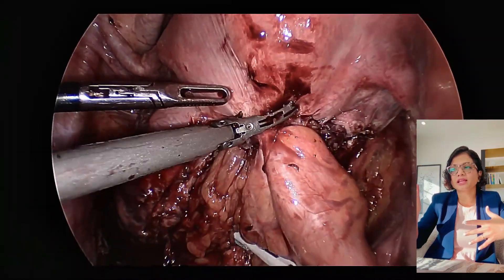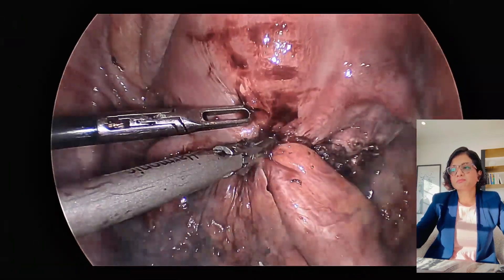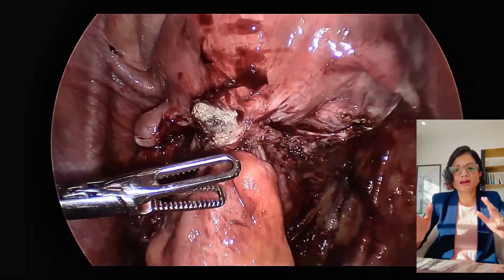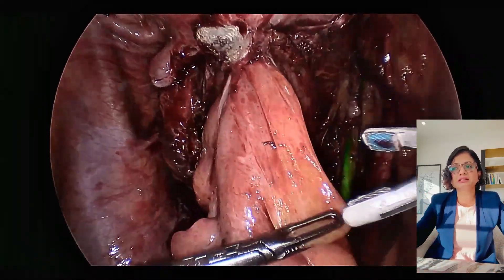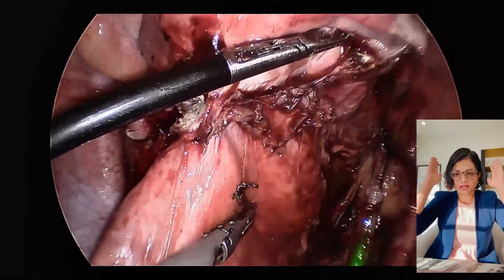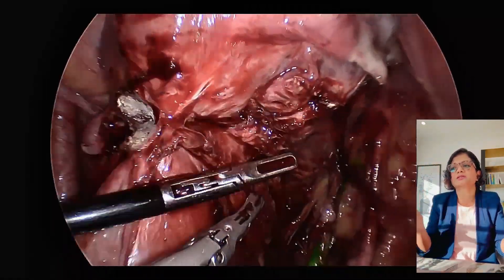That side is done and I had no progress over there. So it comes down to this: just bite the bullet and start off centrally. You try the pararectal spaces, try to get into the rectovaginal space — no luck. That's fine. Just go ahead, bite the bullet, go in head on, because this is what it's meant to be.